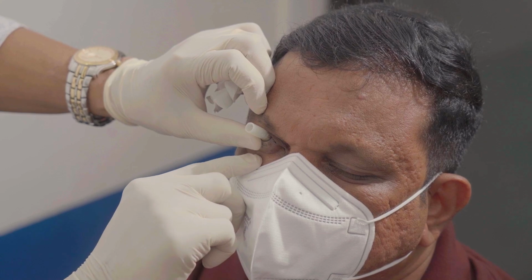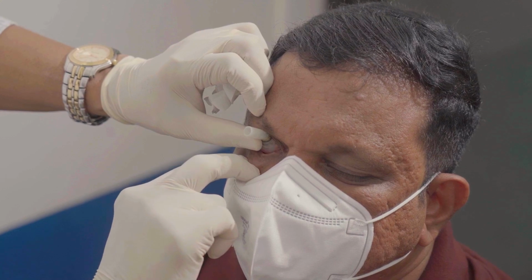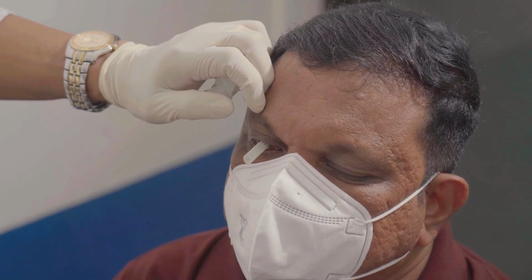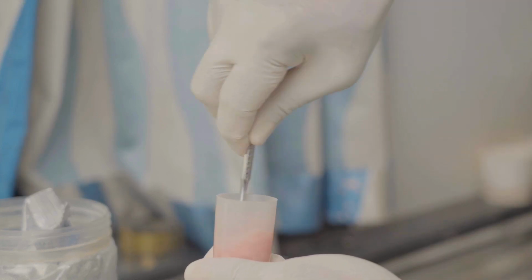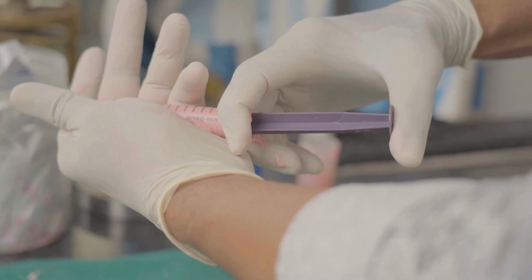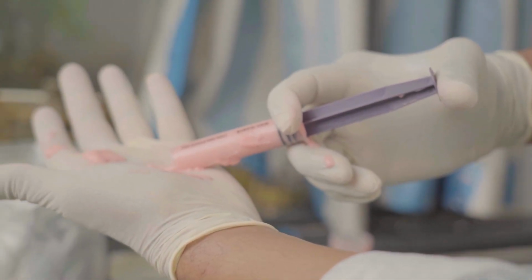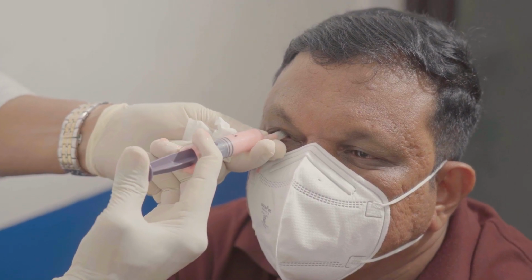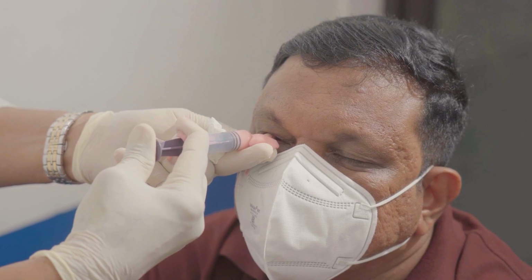The alginate impression of the socket. An impression tray is selected according to the patient's socket size and inserted in the socket. A measured amount of alginate with 10 ml of water is mixed into a flowing paste, loaded into a 10 cc syringe and injected into the impression tray, which is kept ready in the patient's socket. The alginate paste fills the entire sac and starts penetrating through the holes of the tray.